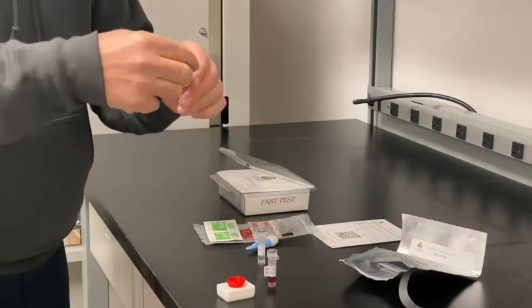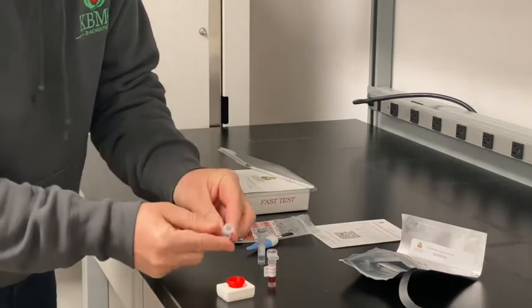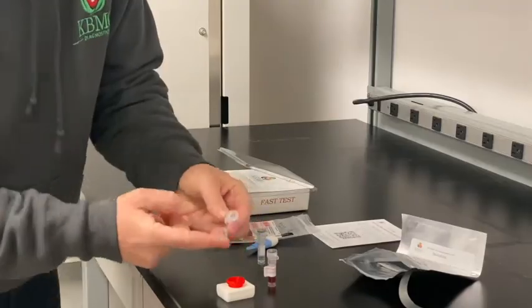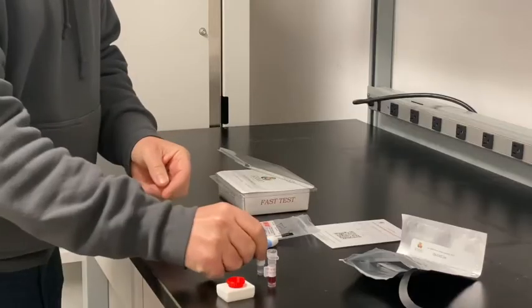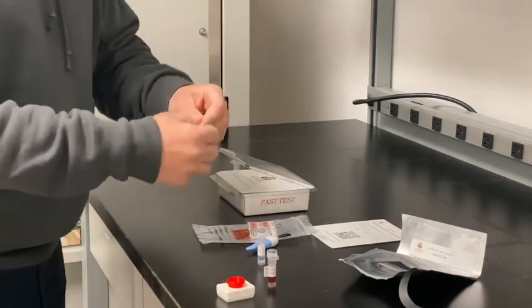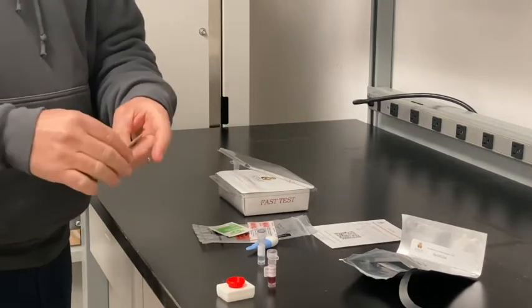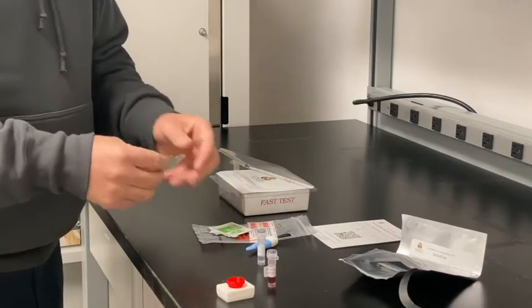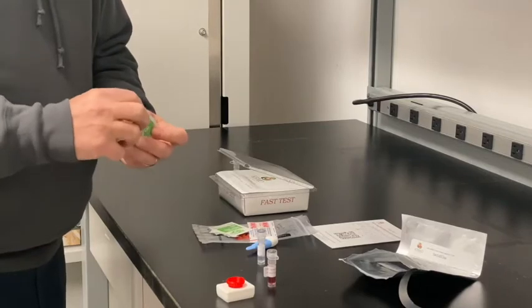Add the contents of vial 1 to the red sample well and let it flow through. Select the finger and then wipe it with an alcohol pad, and then use the blue lancet that's included in the kit, which is a self-activated lancet. Press firmly against the side of the finger.